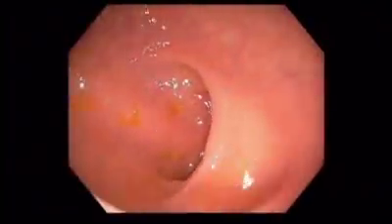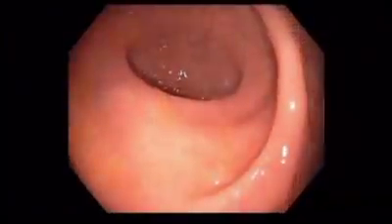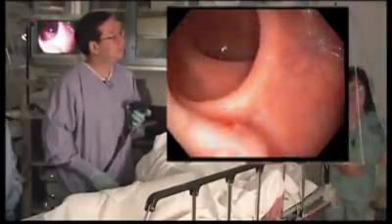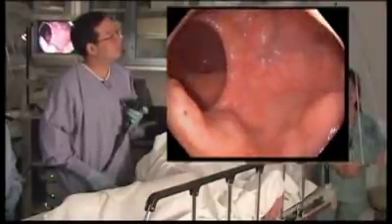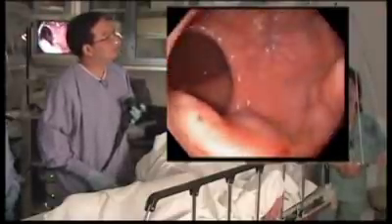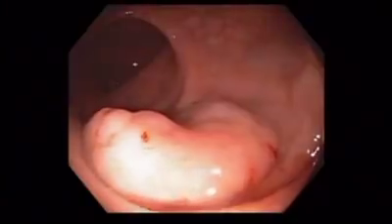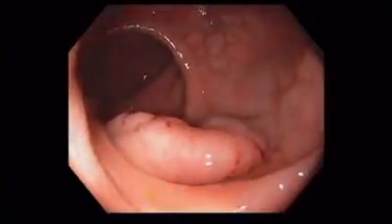Here's the lesion being visualized as we come back into the distal rectum. The lesion appears to have the brainy sulci pattern, typical of tubular villous adenoma.